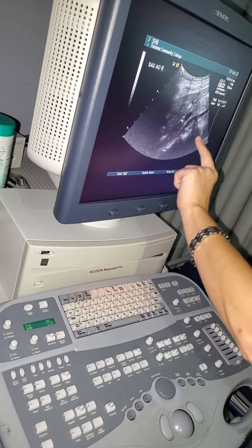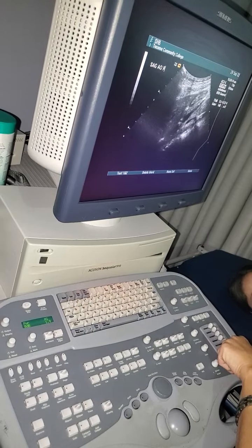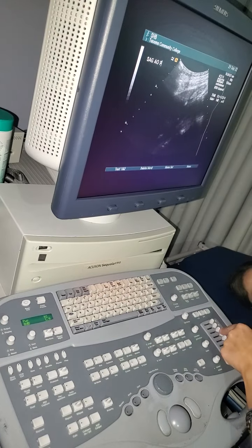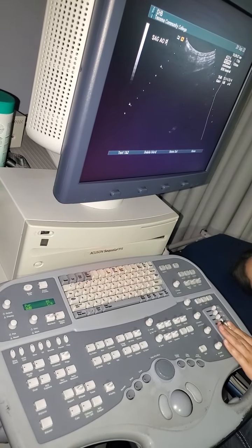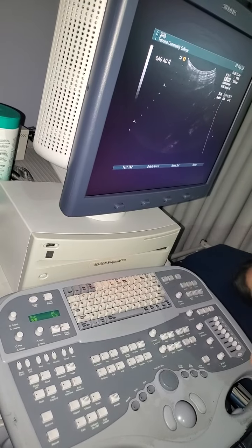We expect, if I'm looking at the spine, I expect it to be a little bit dark, but I don't want to see something like that. Very rarely is one of them out of order with another one. Typically we call them a sweeping curve, so you'll have them kind of in line with each other. And this machine actually shows them to you, some of the other machines don't.